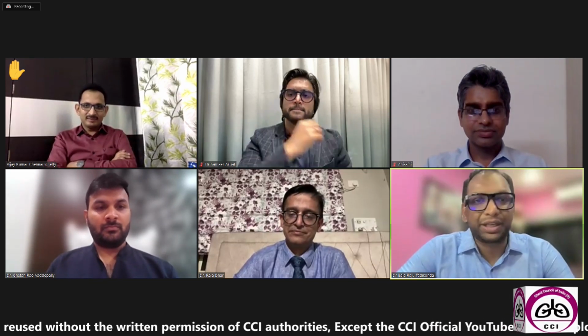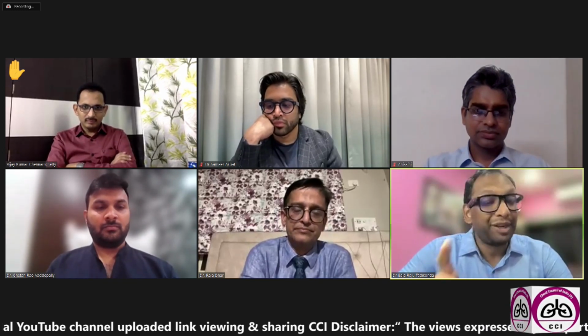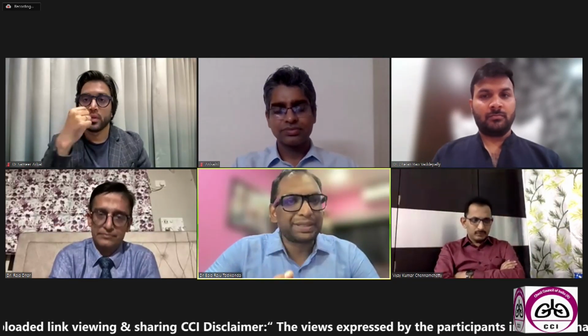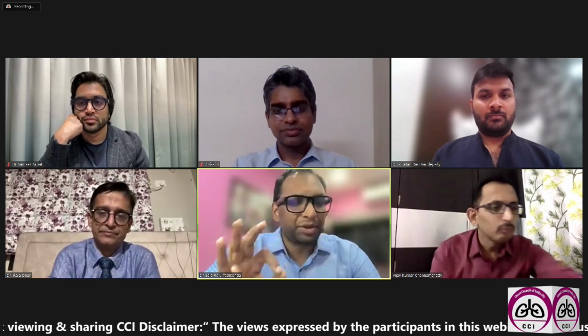Yeah. Bala, your comment. So just wanted to tell the audience, we are very lucky, we have the reusable probe. Let us think, if you're buying a new unit now, you're not going to get a reusable probe. It's always a disposable probe. I feel the major drawback of the disposable probe is it doesn't have a guide. What does a guide mean? It doesn't have a marking at the tip of the probe. If you look at the reusable probe, there is a 1 centimeter mark, 1, 2, 3, 4, 5. So you have a 5 centimeter mark for the reusable probe, whereas this is missing in the disposable probe, even for 2.4, 1.7 or 1.1. And this is a major drawback, I feel.